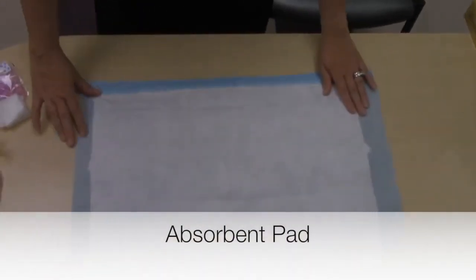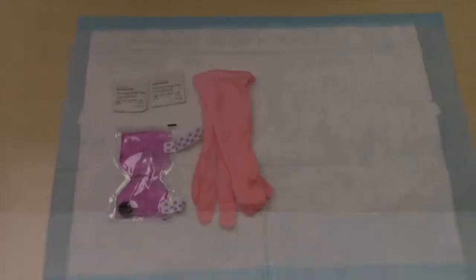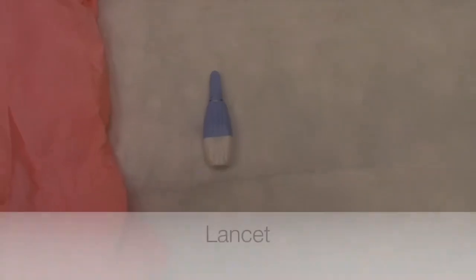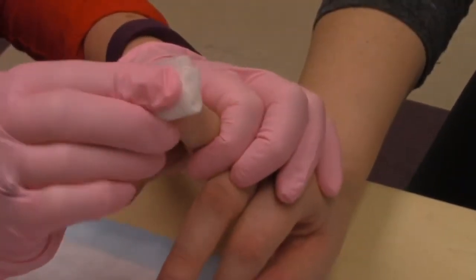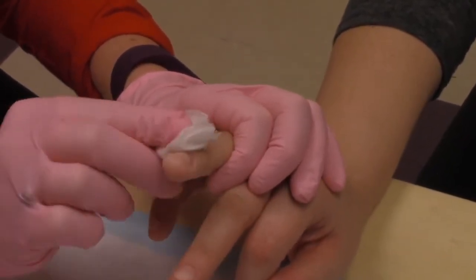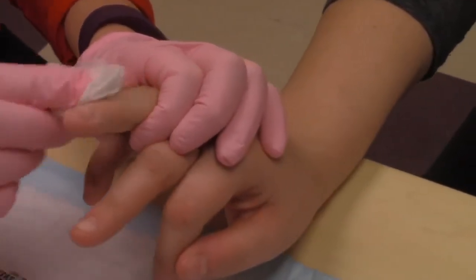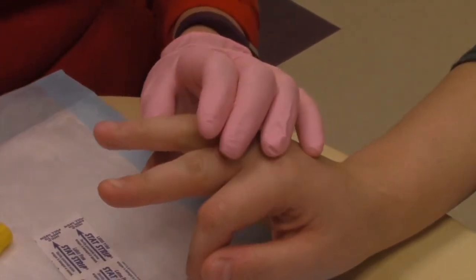You should have an absorbent pad, alcohol swabs, warm pack, gloves, lancet, blood collection tubes, gauze, cotton balls, and a band-aid. Please keep in mind that some children will bleed from the finger poke very quickly so it may get a bit messy. We have included the absorbent pad and gauze to help keep the process as clean as possible.